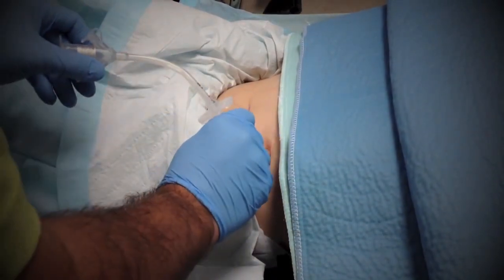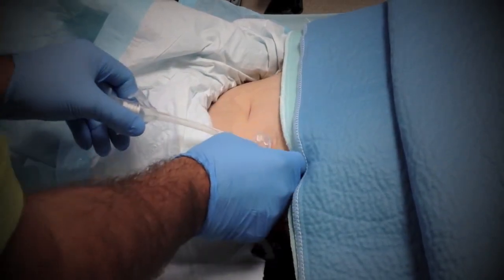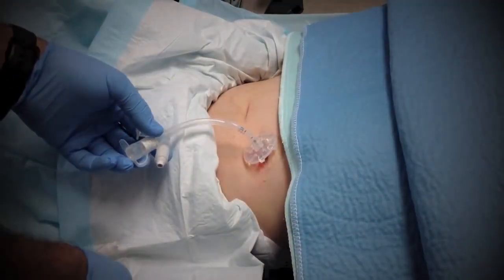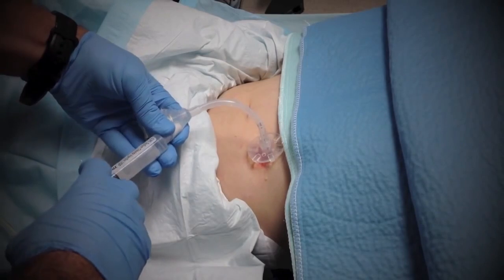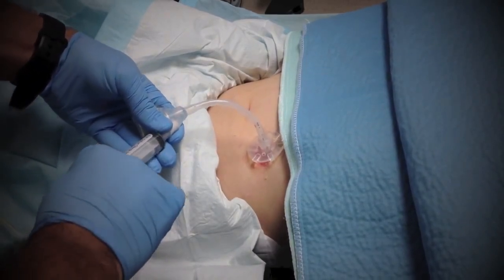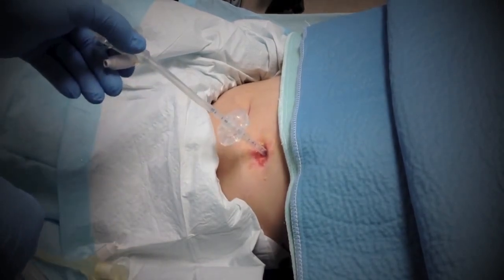And then it's simple. You just put some steady pressure till you're in, and you push it as far as you want. The stomach is big, so there's plenty of space for things to move around. It's not like we're going to go through and through the stomach. And we go ahead and inflate the balloon all the way in. Okay, Nikki. And we pull back, and that's where I meet the resistance.